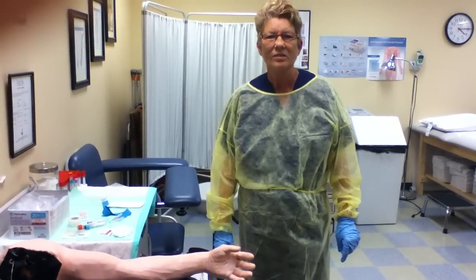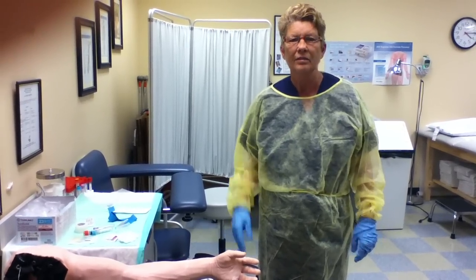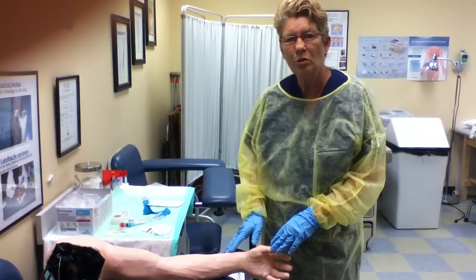Good evening class. This is going to be a quick lesson on venipuncture on a mannequin. For the purposes of this video, I've already identified my patient. His name is Joe Brown.